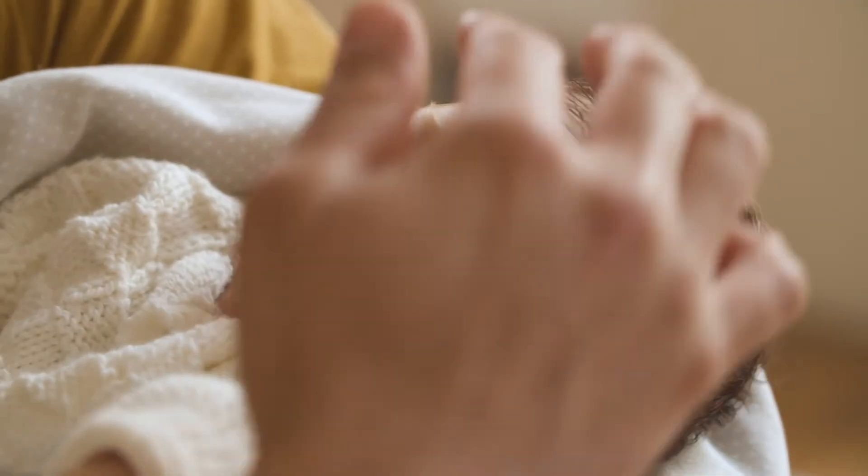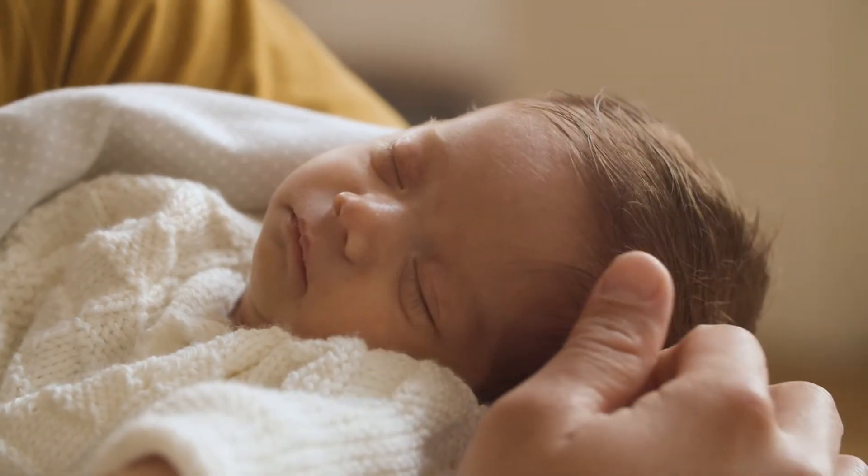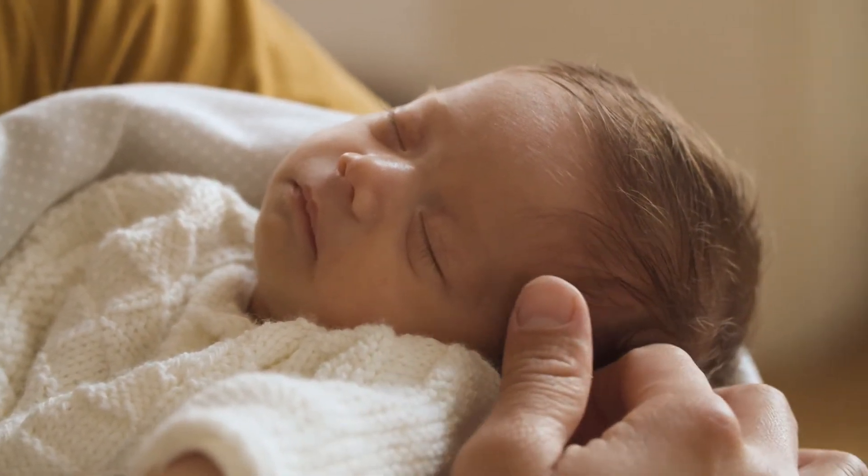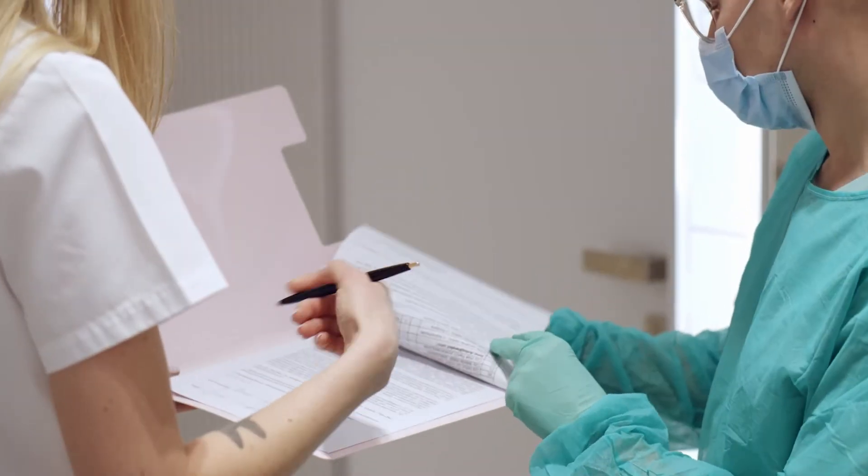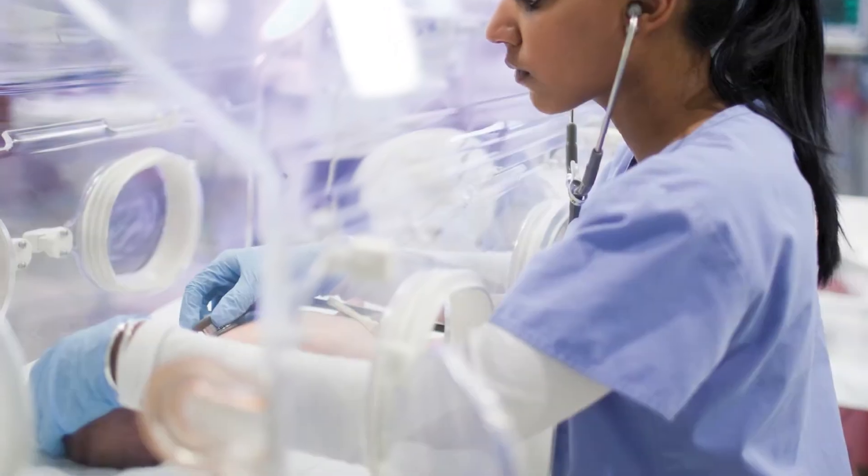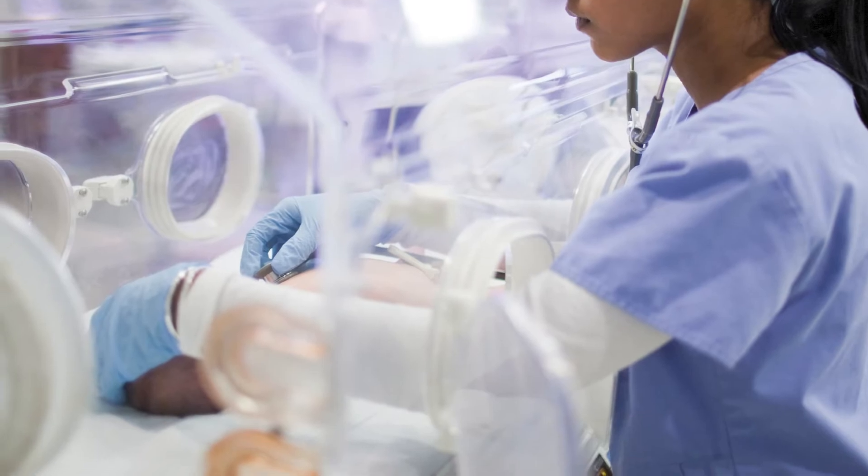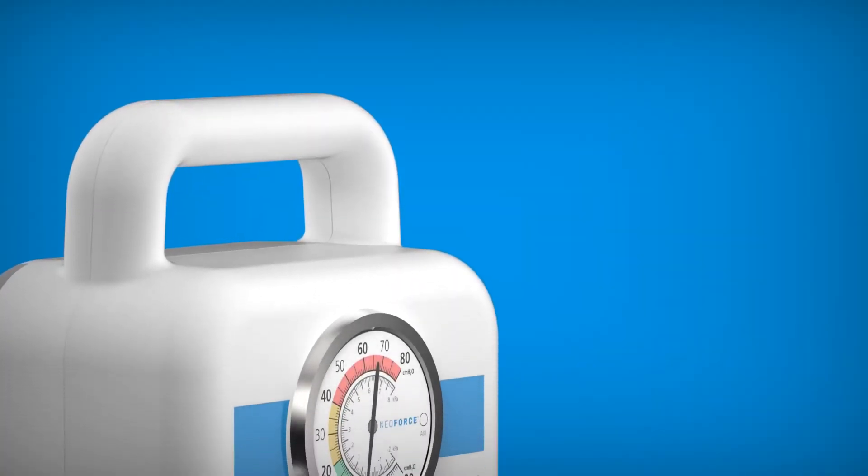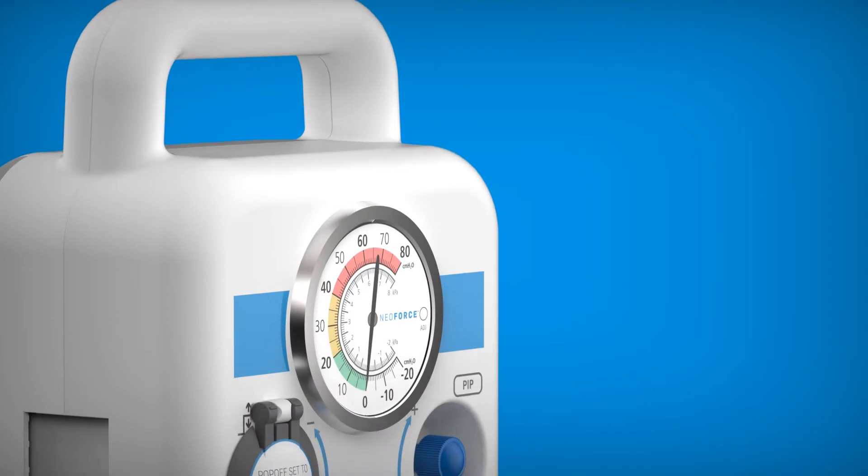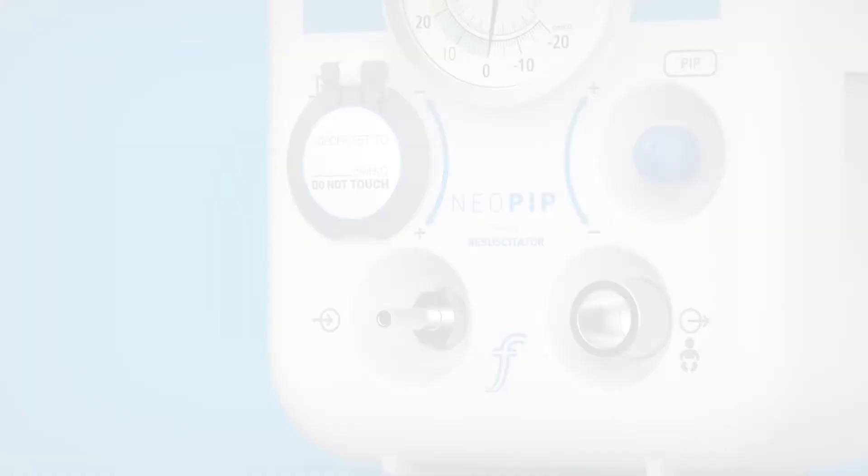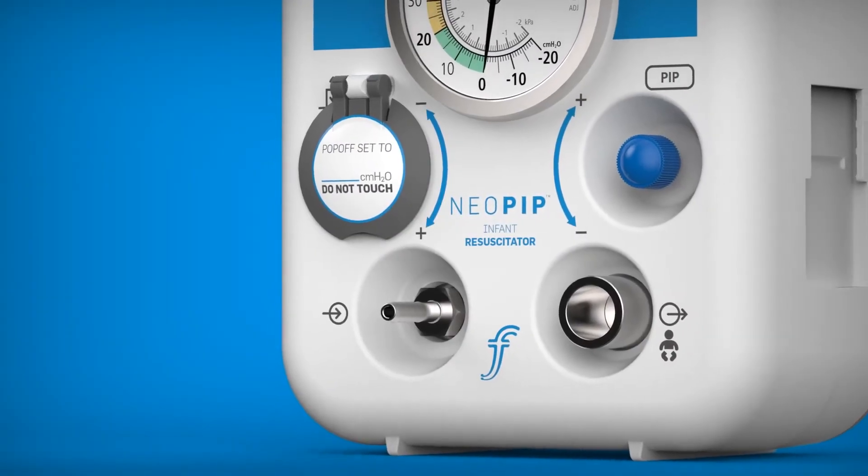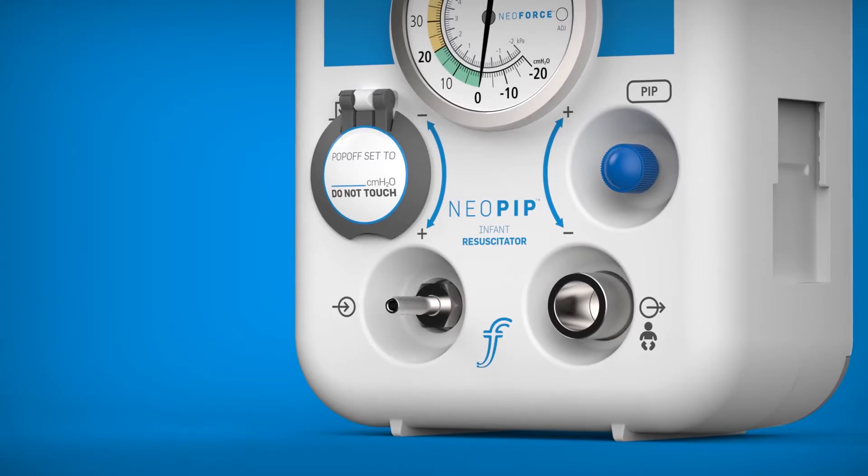FlexiCare's Neopip Infant Resuscitator is intended for emergency resuscitation of infants up to 10 kilograms in delivery suites, nurseries and neonatal intensive care units. The pneumatic device delivers oxygen or blended gas to a patient while controlling peak inspiratory pressure and providing maximum pressure relief capability.